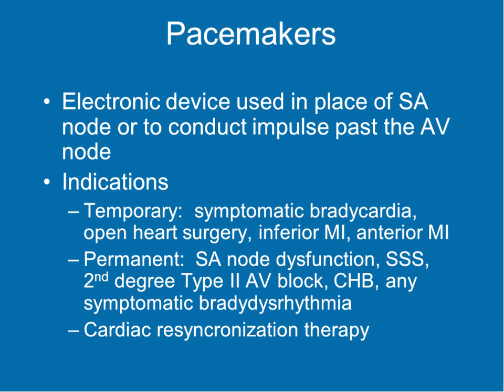So why do we use pacemakers? Well, we can use them temporarily for any symptomatic bradycardia that wasn't responding to medicine. They're often available for open heart surgery. The patient will come back with pacer wires sticking out of their chest in case we need to hook up a pacemaker.